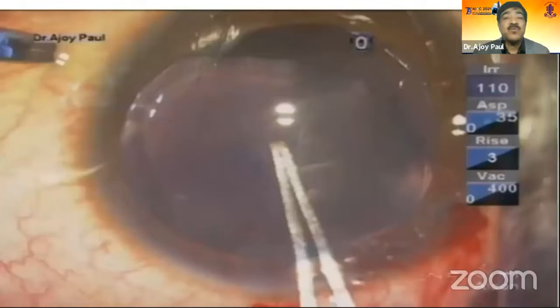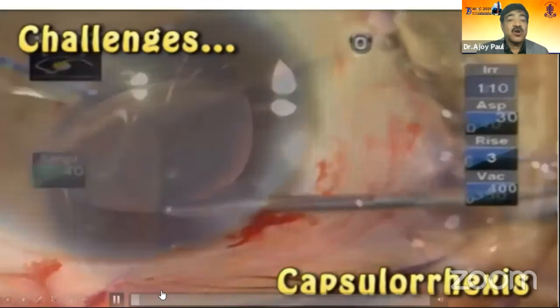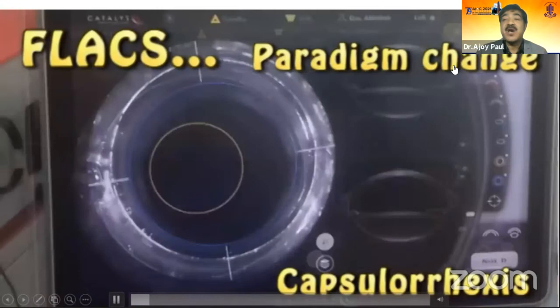Now, I've just come to see the rhexis can be a tough job, as you can see. In this case, with the rhexis, you are trying to get it and match it. And many a time, we put even an iris hook to keep it, but not always that we end up there, especially in this extreme subluxation, it really becomes difficult. And especially if we are doing the nuclear fragmentation, you have got an unstable bag, and chopping that nucleus sideways, definitely this femto has actually changed the paradigm of how we do that rhexis.